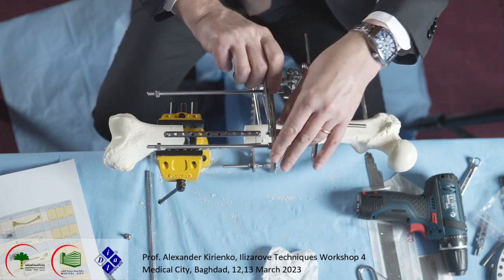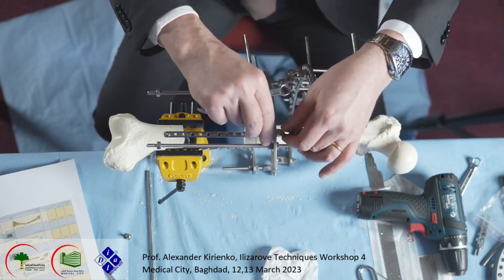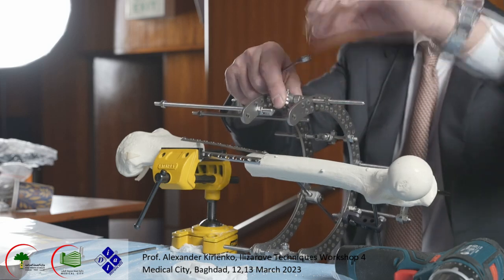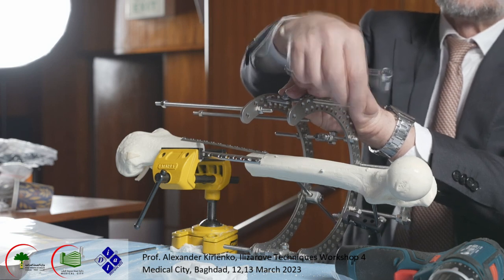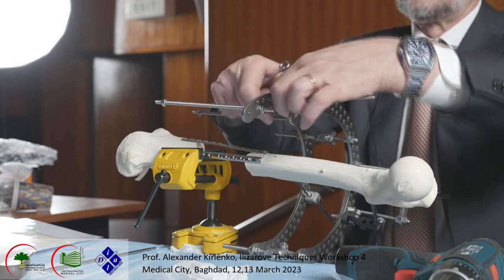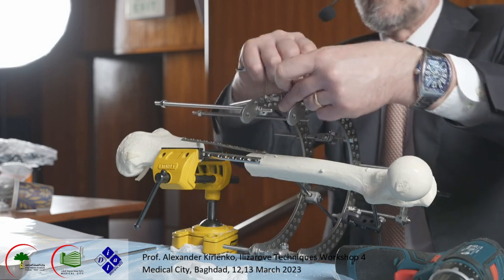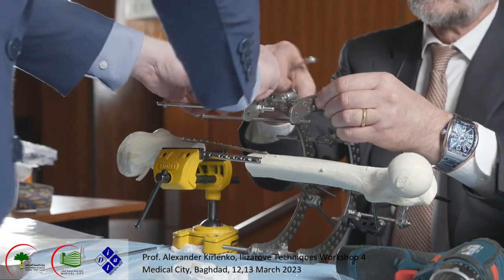Now I change this because I don't like this system. Why I don't like it? Because this rod is too much anterior. For the patient, it will be uncomfortable. We do it the same way, all of this system. Like this. And I put it down, and this way it functions good. Same system.